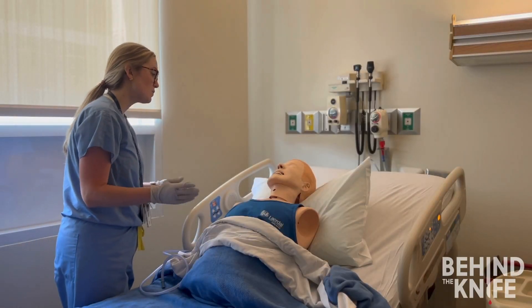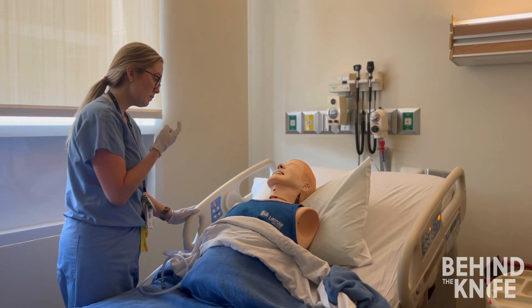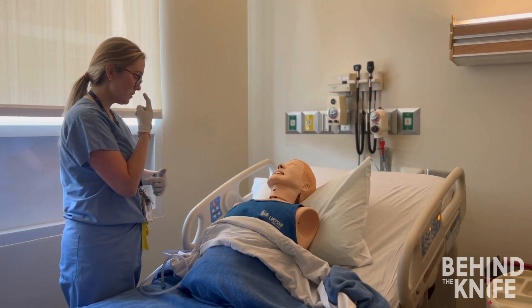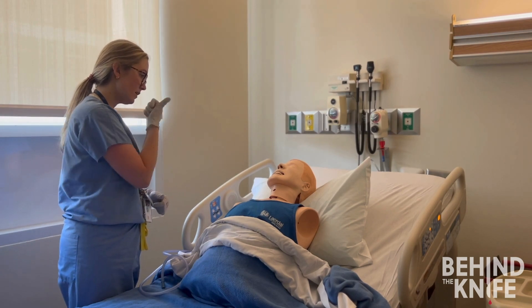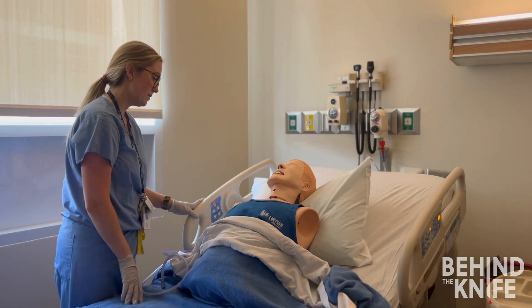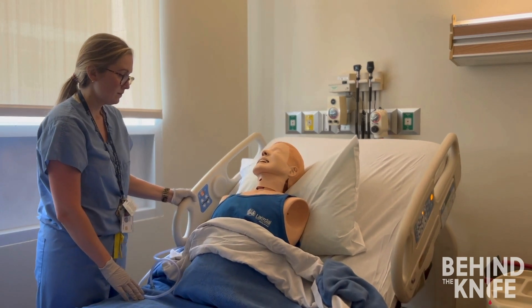To begin, you should talk to your patient and explain why a nasogastric tube is important for their care. I'm honest with my patients — I tell them that placing the nasogastric tube is normally miserable, but most people feel better once their stomach is decompressed. It's important that your patient is on board and understands that you want them to focus on swallowing the tube. If you don't have an honest conversation up front, it can make placing the tube more difficult.